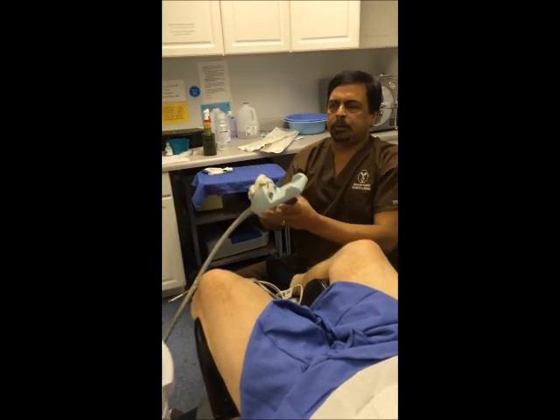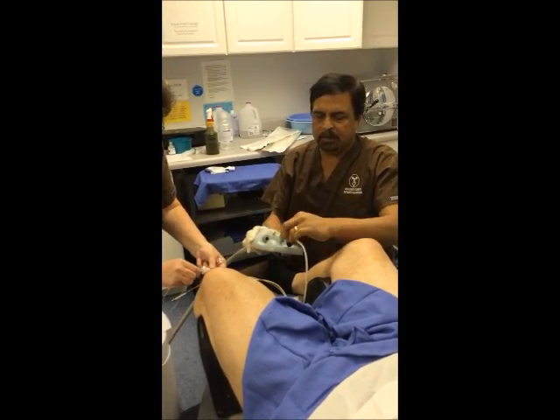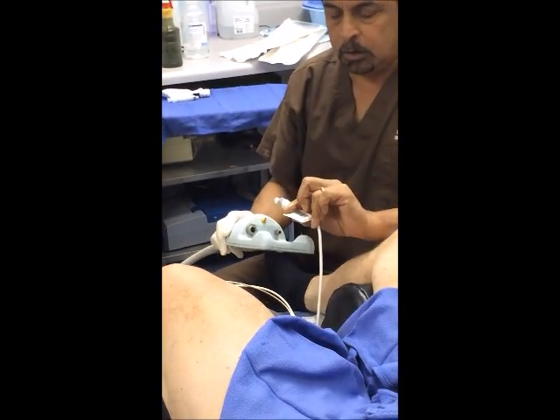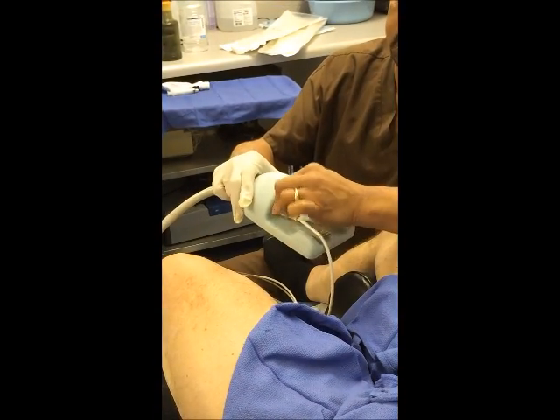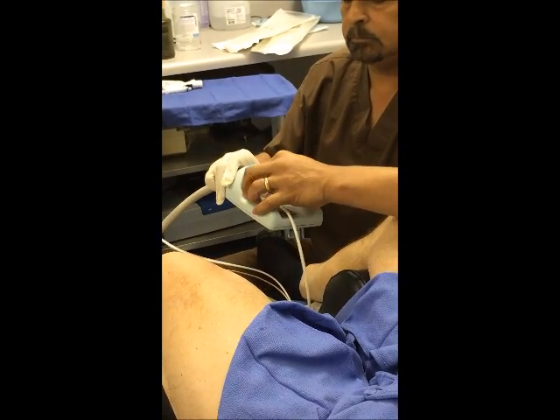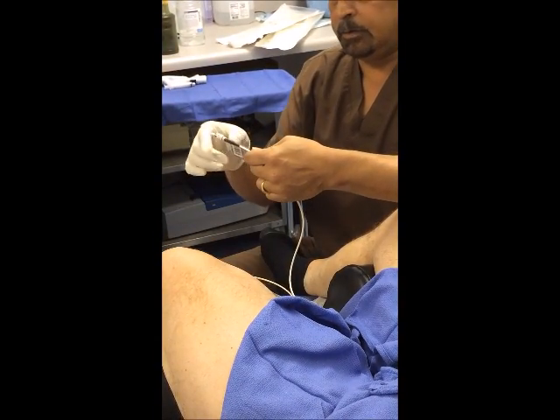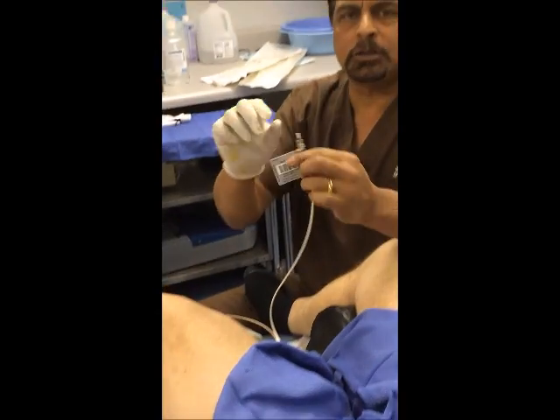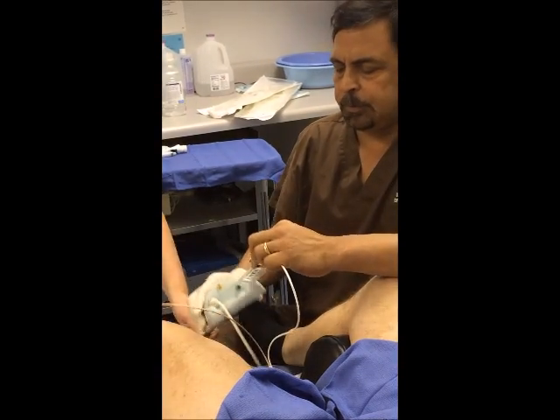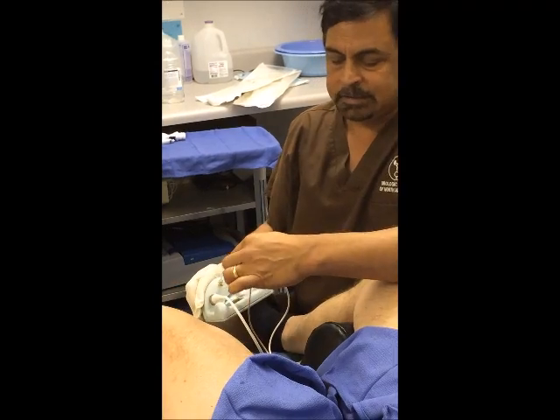This is attached to the catheter and this is attached to the machine. There are three different slots for three different connections — you cannot go wrong with this. This is the treatment part; it goes in and you turn it once and it stays there. This other connection is for the prostatic urethra — it monitors the temperature of the prostatic urethra. There are different slots for different things, and this component gets really hot.